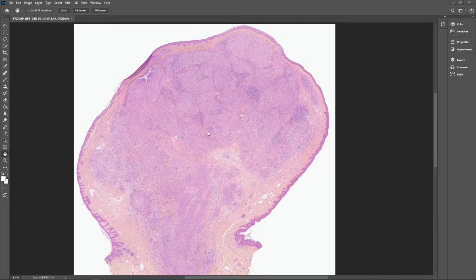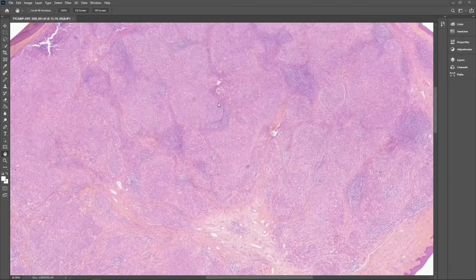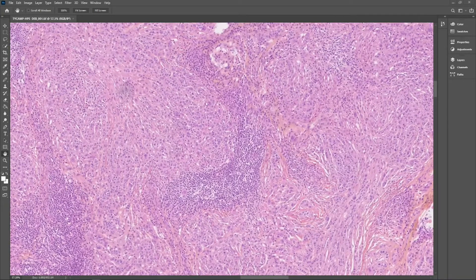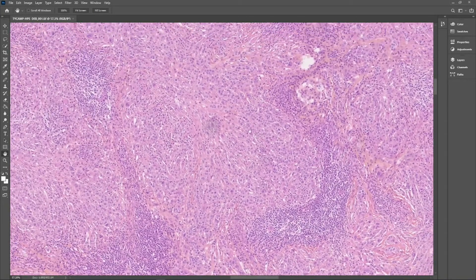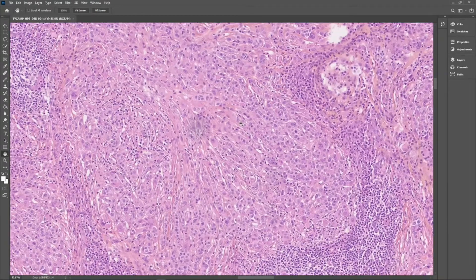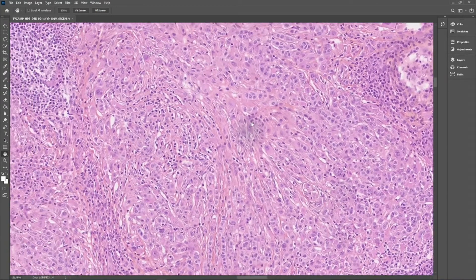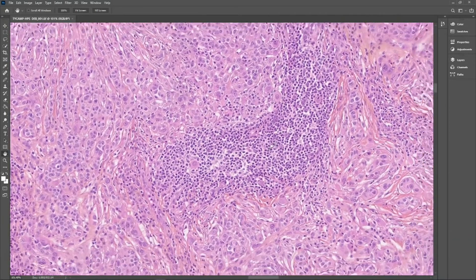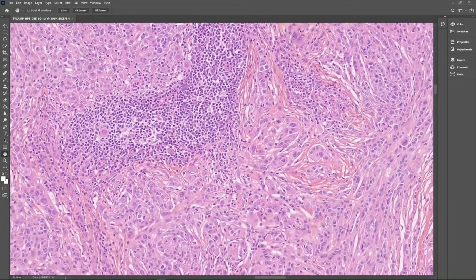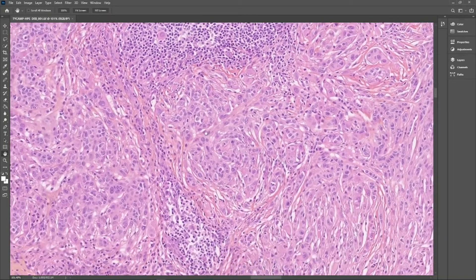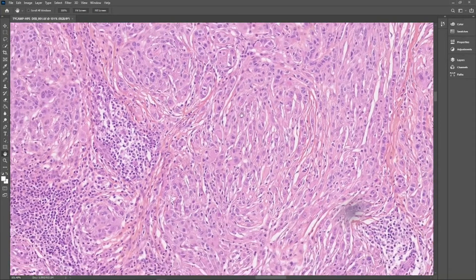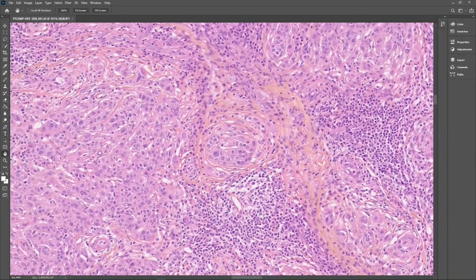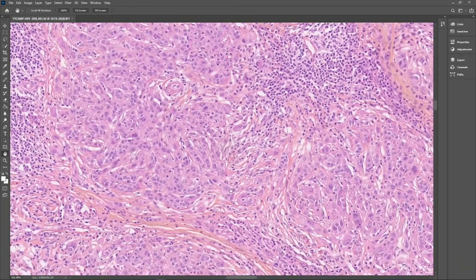At higher magnification, we can see the clone is made of loose sheets and nests of melanocytes. These have some epithelioid and nevocytoid cytology. There are some areas with a large amount of lymphocytes and there is some degree of fibrous and edematous background. There is almost no mitotic activity, maybe a few dispersed mitotic figures.